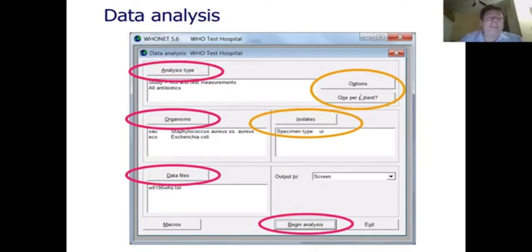So if I have a patient with 10 isolates of Staph aureus, I recommend putting all 10 isolates into WHONET. For certain things, I want to see all 10. Maybe the patient started with sensitive and maybe the isolate mutated to resistance. Maybe the patient has multiple distinct strains. Maybe the patient moved from location A, B, C. So if the patient has 10 Staph aureus, I want all 10 Staph aureus in the database. But when I'm doing my annual statistics, I do one per patient. I don't want the patients with multiple isolates to bias the result. So WHONET is very flexible and permits you to remove repeat isolates in a number of ways.